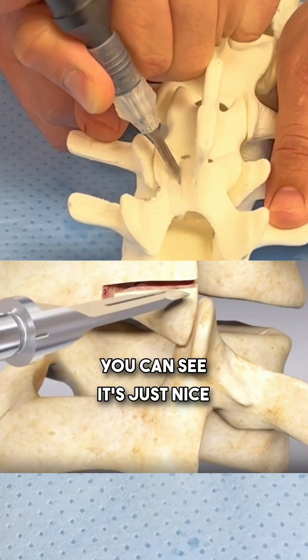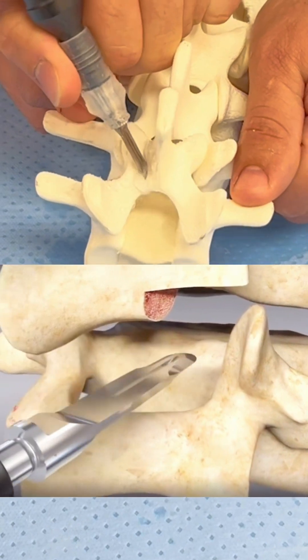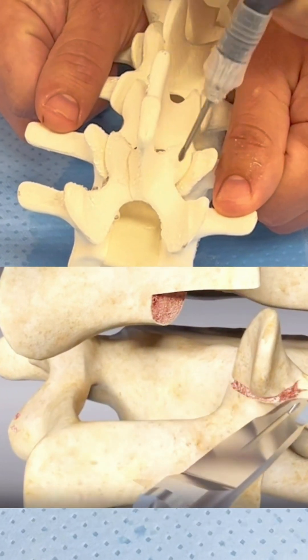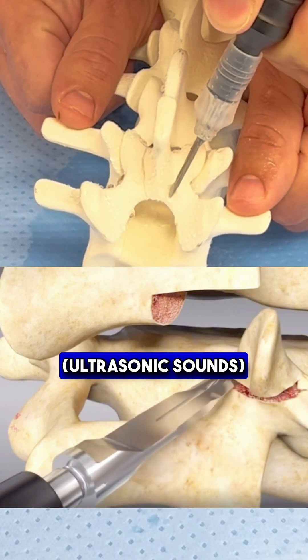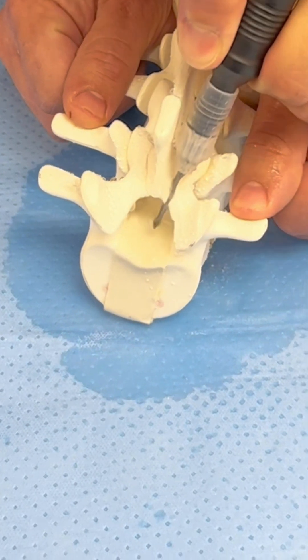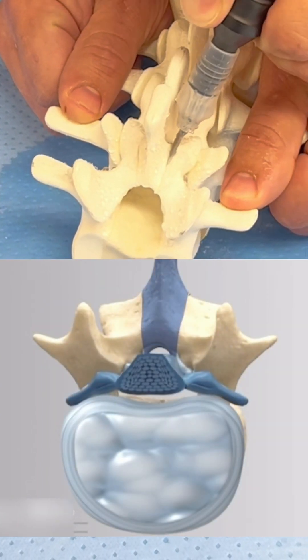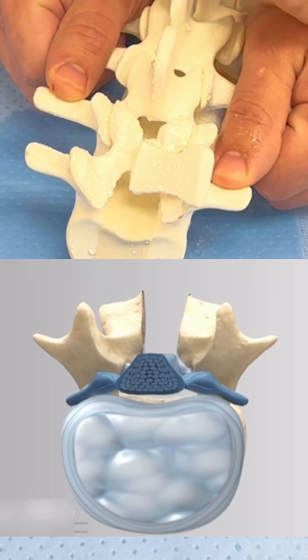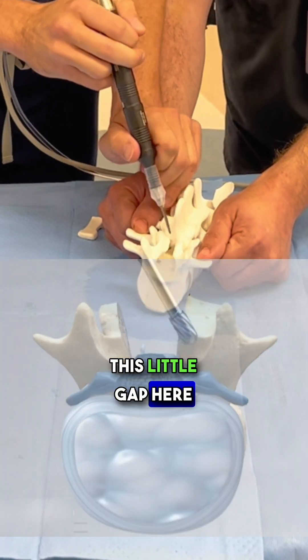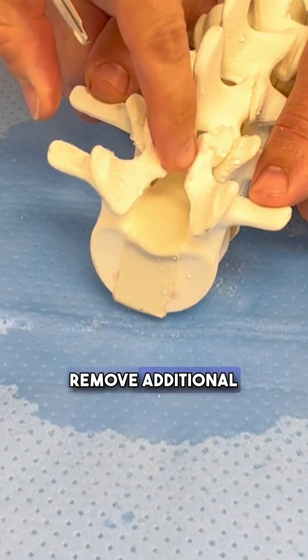You can see it's just nice and easy cuts. Just like that, we'll now have a cut in the bone. This little gap here is where the surgeon can now minimally go in to remove additional bone spurs.